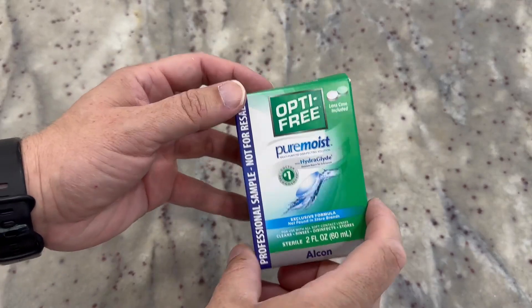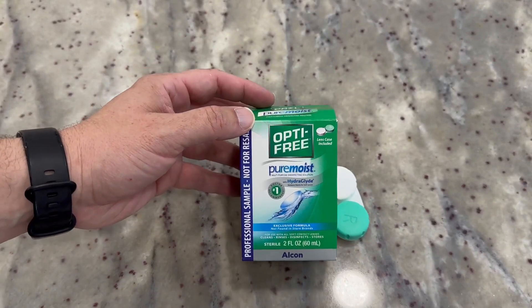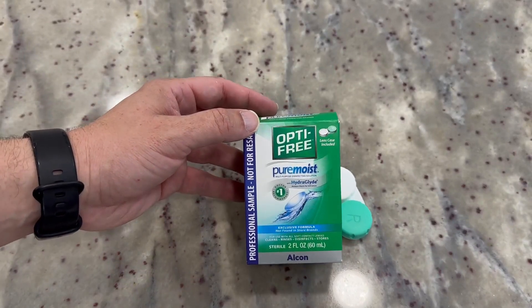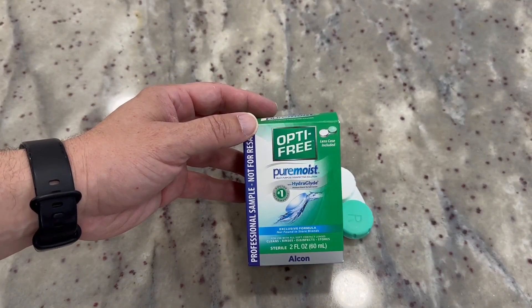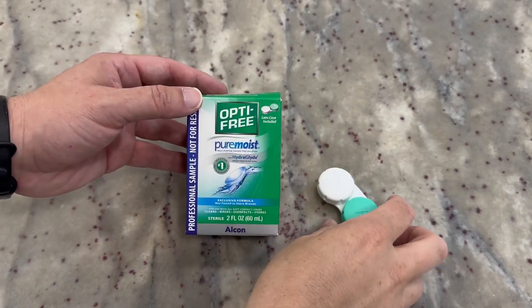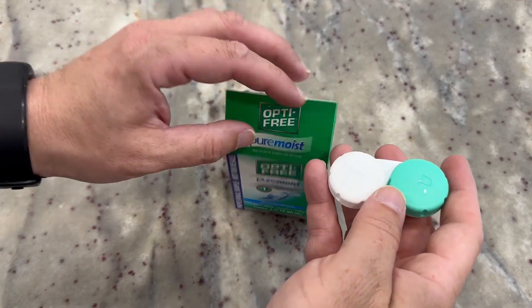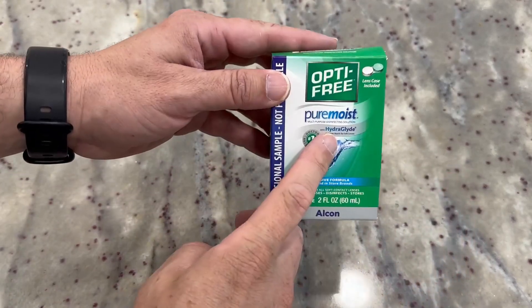Hey there, my name is Scott and this is a quick video for Optifree contact solution. My wife is a brand new contact wearer — she's had glasses on and off for quite a while, but now the optometrist says it's time for contacts. She's been getting used to that, and if you're used to contacts, you know it's a bit of an adventure. The optometrist recommended this for her to get started with.